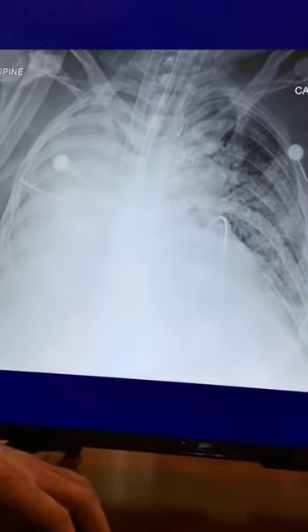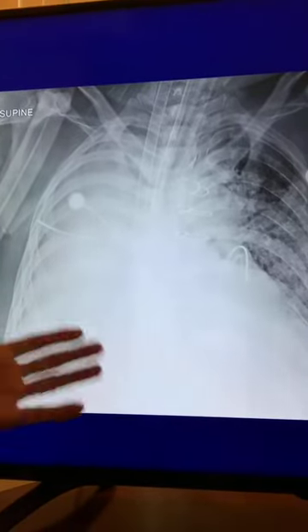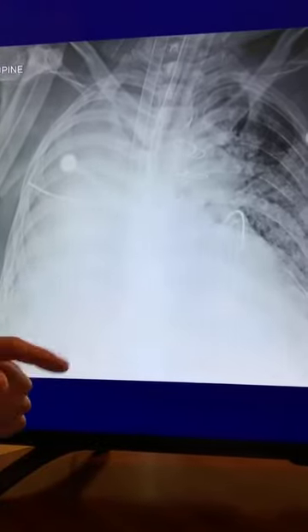A lot of you looked at this case, and I don't want you to be looking at chest X-rays anymore like, for anybody who doesn't know my way of thinking, they just go straight up, oh, it's a lung whiteout, it's a big old effusion, next, right? No. Systematically, whatever I've been teaching you, I want you to go over this kind of stuff systematically. So look at this chest X-ray and let's go over the differential of complete whiteout. Why is it completely whited out? This actually has an even bigger hint as to why this is all completely whited out. Do you see this right here?